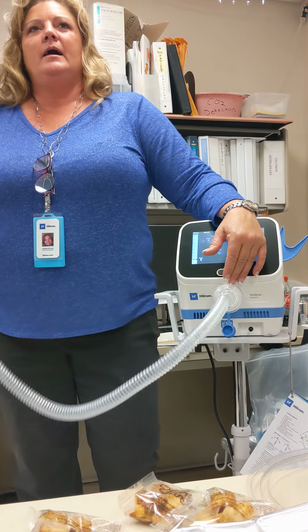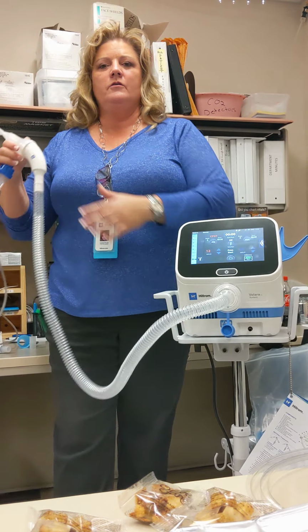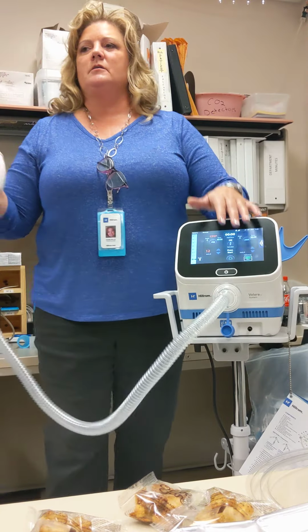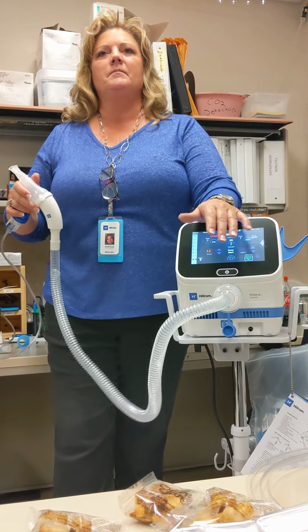On our vent patients, it's the same thing. You're not going to be on it long enough to get any rainout. That's going to be great. If you do, call us. We'll go through it. We're probably missing something.